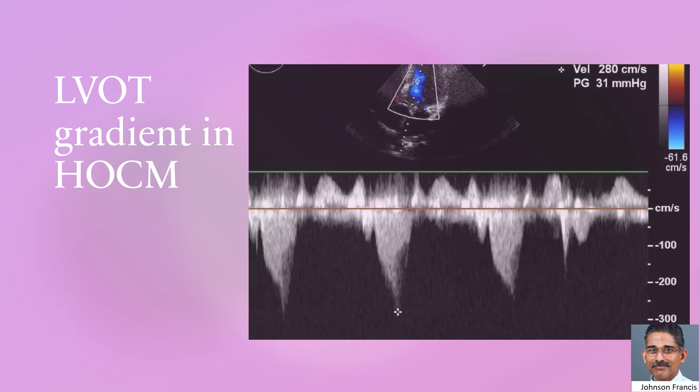The typical dagger-shaped or sickle-shaped LVOT gradient pattern in CW Doppler is demonstrated in this picture. We can see that the beginning gradient is low and it increases as systole progresses, peaking towards late systole. This is the dynamic nature of the obstruction, and it is also seen that there is variation in the gradient from cycle to cycle. These are all part of dynamic LVOT obstruction in hypertrophic obstructive cardiomyopathy.